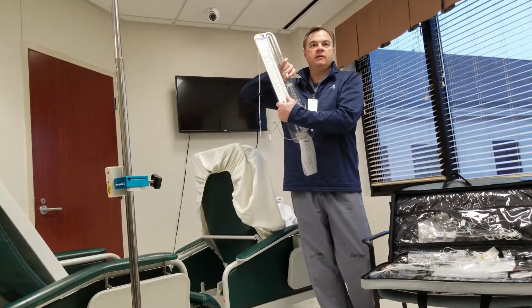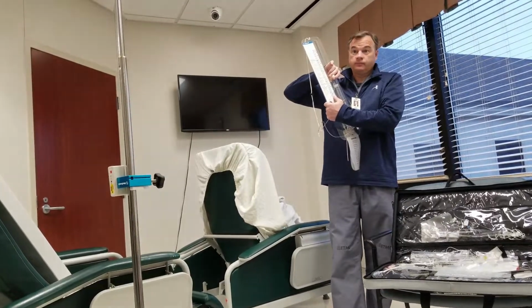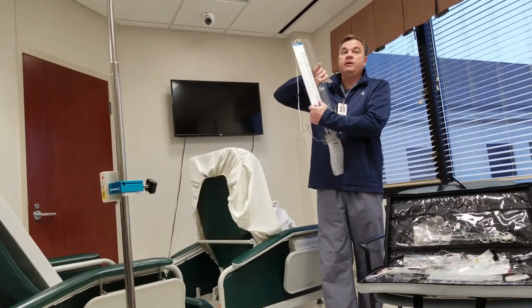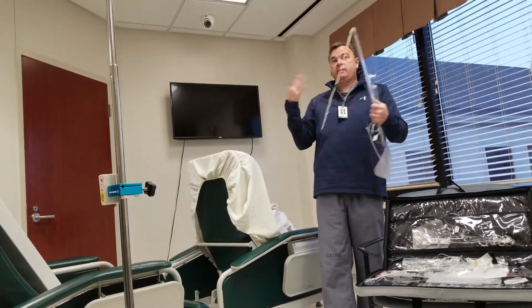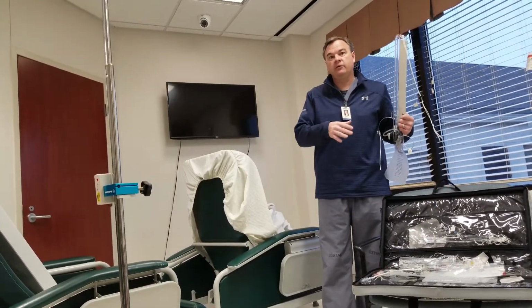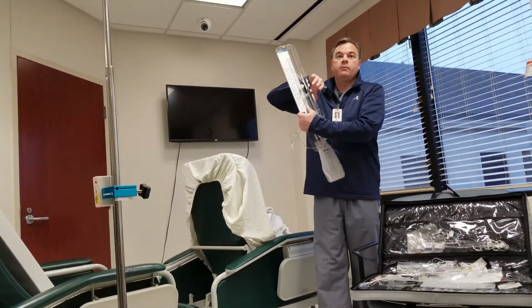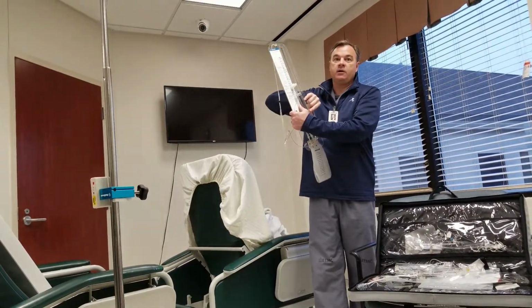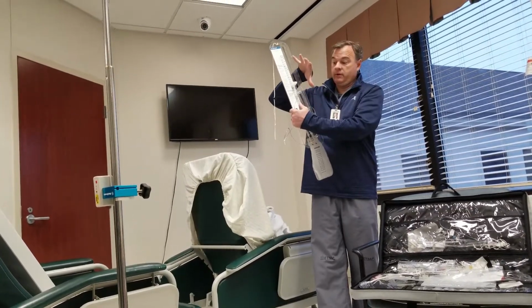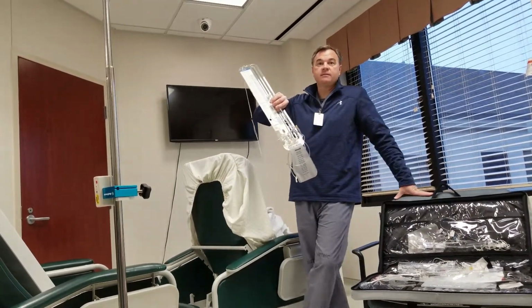I think the redundant order for volume is confusing. It was confusing to me when you guys called. I texted Matt, and he said he just wanted to make sure things were moving, that 8 wasn't too high, that it wasn't a tsunami of CSF, and that 8 wasn't too low. So I think it was more of a belt and suspenders. He wanted orders written at the pressure, but also wanted either him or Dr. Pelosa to get a call if it wasn't dripping or was dripping an abnormal amount. That's where it came from. But that's a good question.